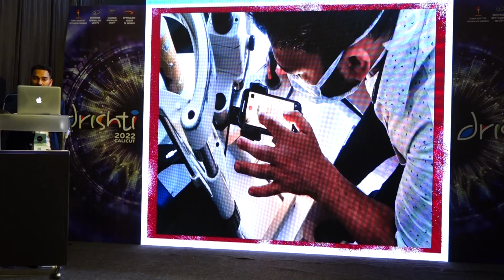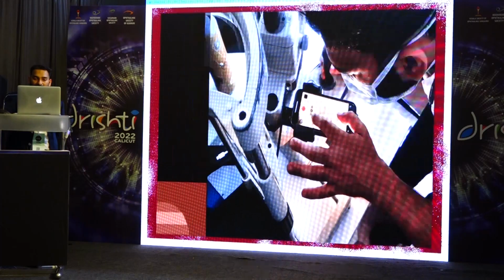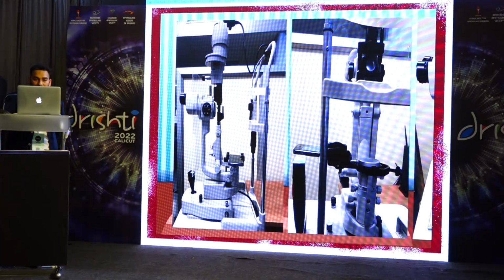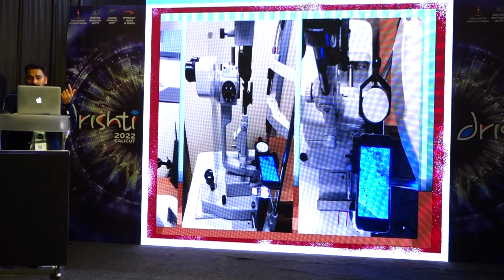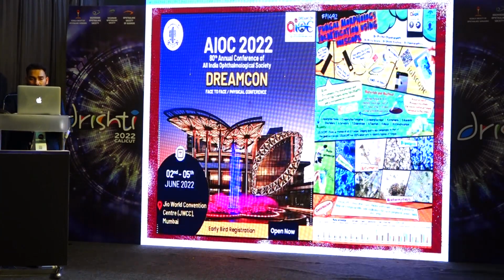Basically, now we are doing it for fungal hyphae. The one for bacteria and viruses, we have not yet refined. Here you can see you can even put it on top; you don't have to remove the illumination part, you can just keep it on top of this.